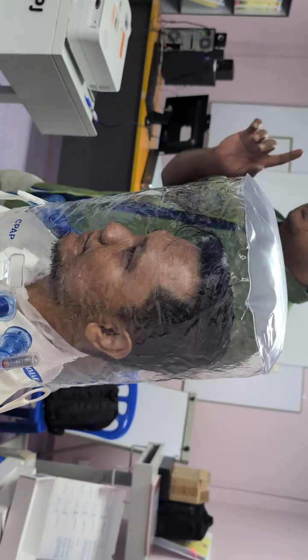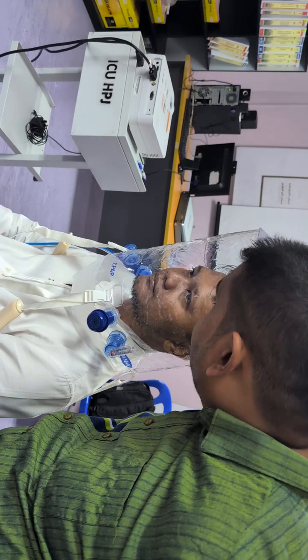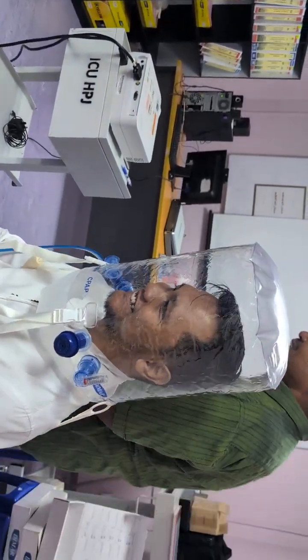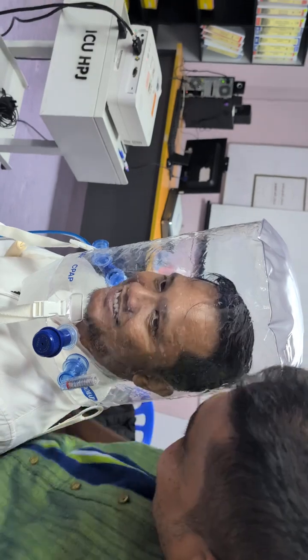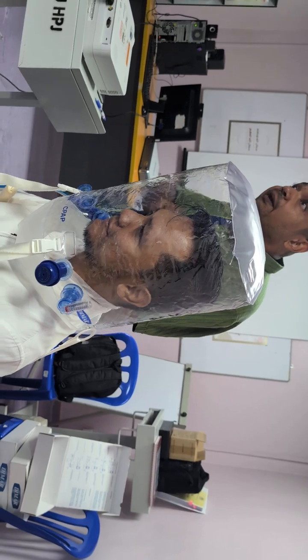So, you see guys, just now, if I want to ask the patient wearing this mask, Eddie, what did you have for sahur this morning? Biryani. You haven't had biryani this morning? Okay, so the patient will still communicate back to you.